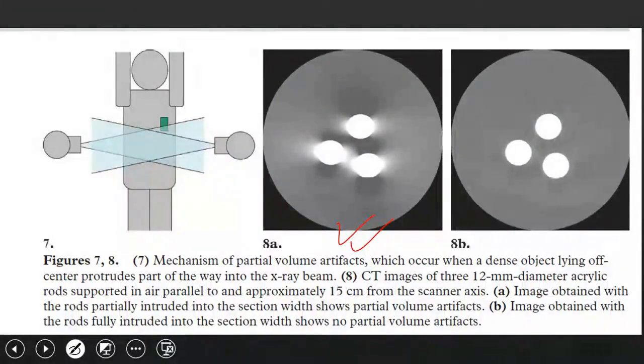Because, as I mentioned, this part is located on the peripheral field of view that was taken. In some projections, certain images may not be visible during the imaging process due to the use of a small field of view. For example, in this case, artifacts appear as a result of the averaging that occurs in the transmitted photons reaching the detector.